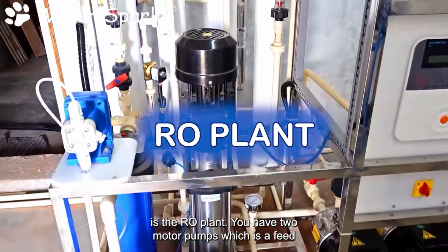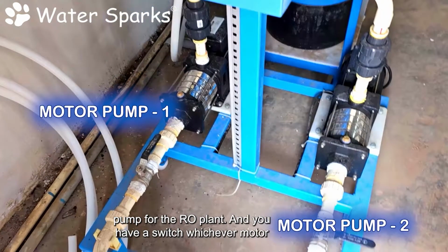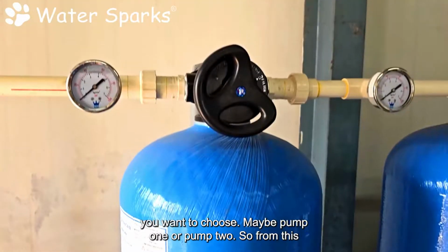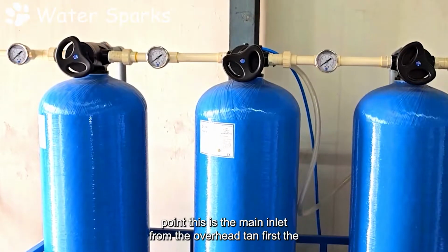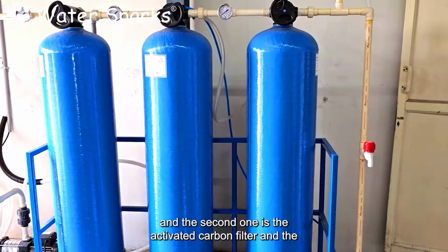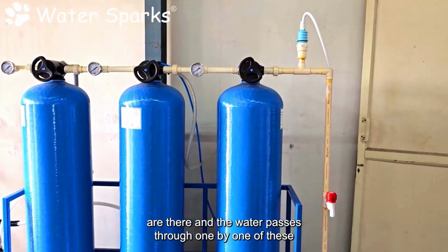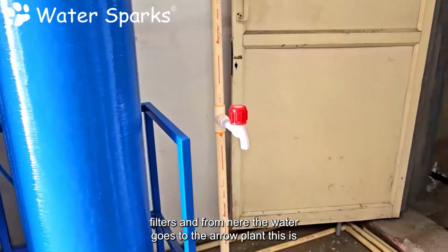And this is the RO plant. You have two motor pumps, which are the feed pumps for the RO plant, and you have a switch, whichever motor you want to choose, maybe pump 1 or pump 2. From this point, this is the main inlet from the overhead tank. First, the water goes to the sand filter, which is a multi-graded filter. The second one is the activated carbon filter. And the third one is a water softener. The water passes through these filters one by one, and from here, the water goes to the RO plant.